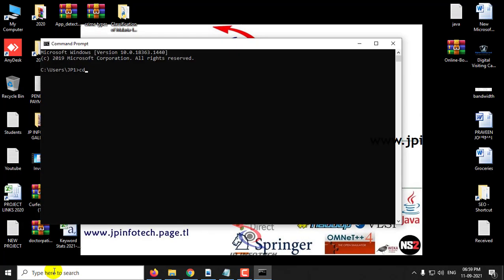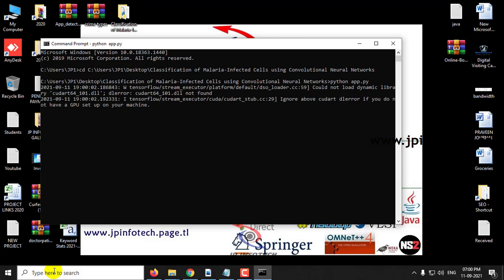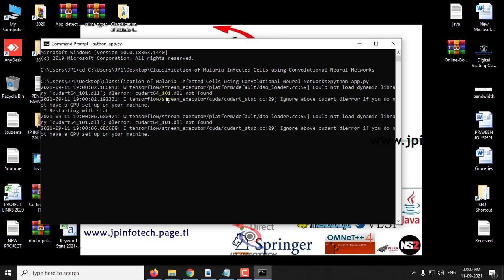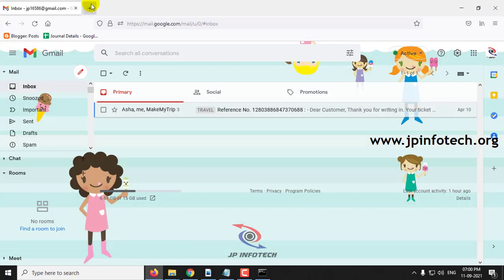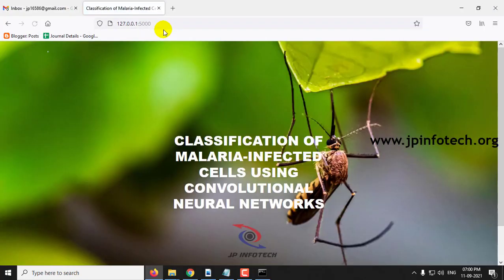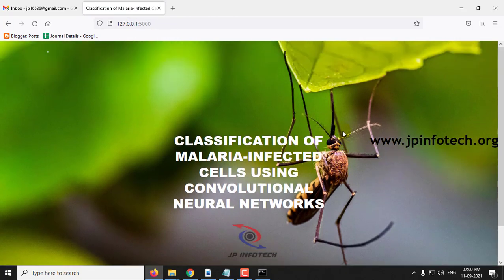Go to the command prompt, go to the source code location, type python app.py. Now you can copy this URL, go to your browser, paste it, and you can see the home screen and welcome screen of the project.